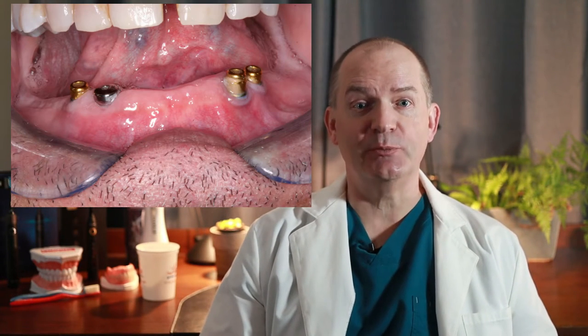At-home maintenance for snap-in dentures is pretty simple. It consists of taking care of the denture and taking care of the dental implants in your mouth. The snap-in denture itself can be cleaned like a regular denture. You can soak it in denture cleaner, then brush it off with a denture brush or regular toothbrush. But don't use any toothpaste on it since the toothpaste can scratch it. This will help remove some of the plaque and tartar that will build up on it in your mouth.